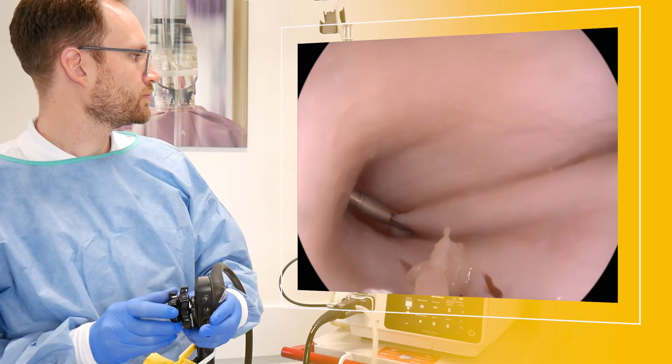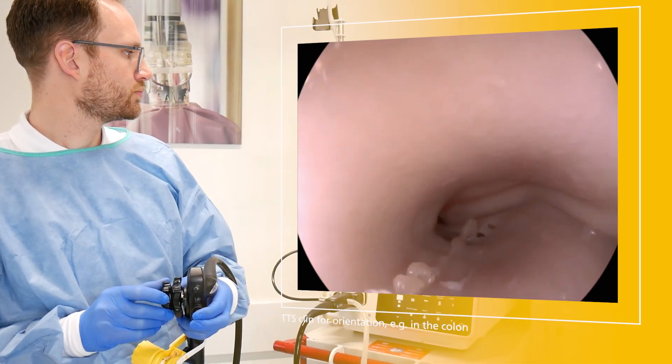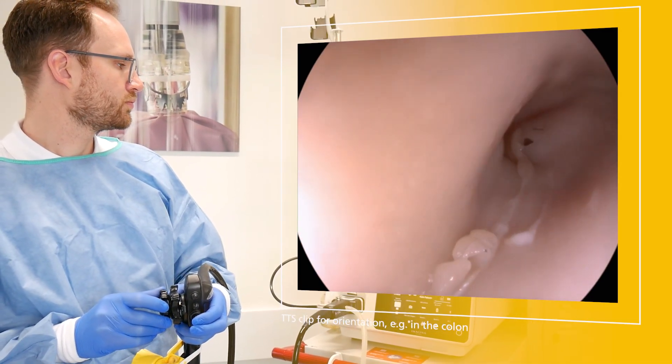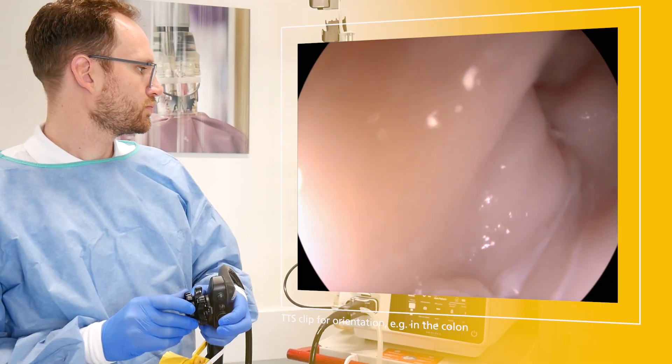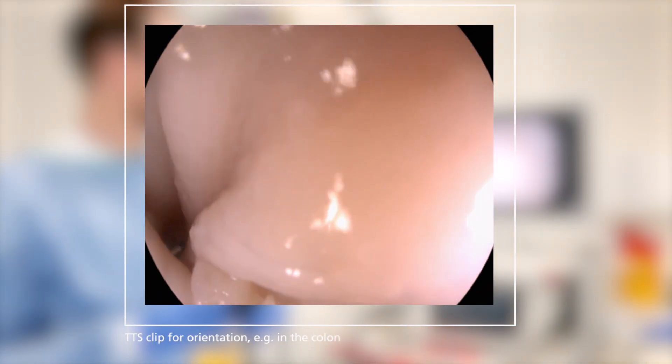For necessary closure of perforations and reduced visibility, for example on the colon, placing a TTS clip slightly distal to the perforation can help to easily relocate the site.